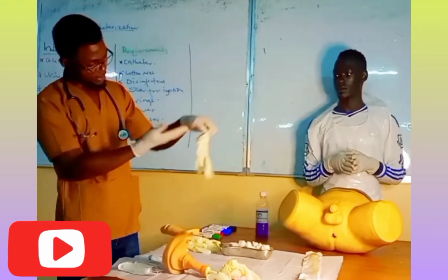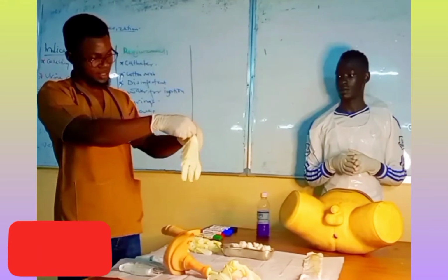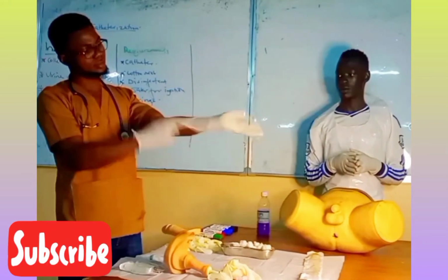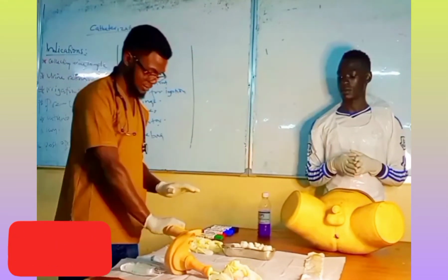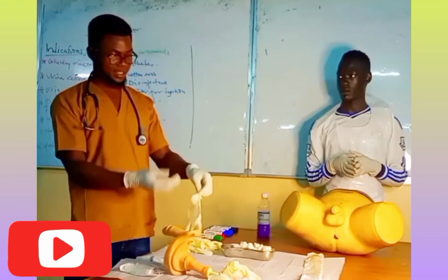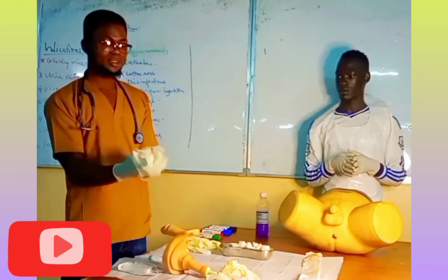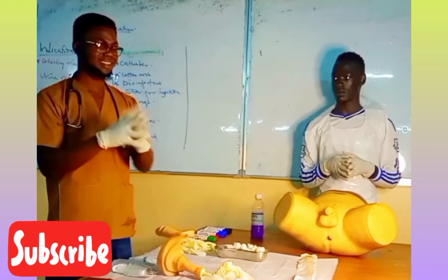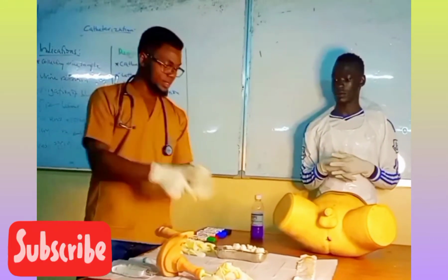I put on my gloves. This one is in the left, holding my cuff. When you know how you hold the cuff, it becomes very easy to wear the gloves. You open for me.